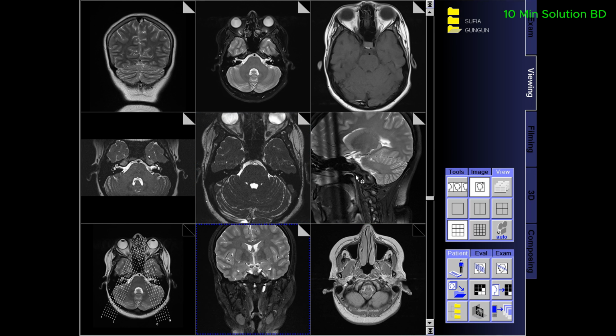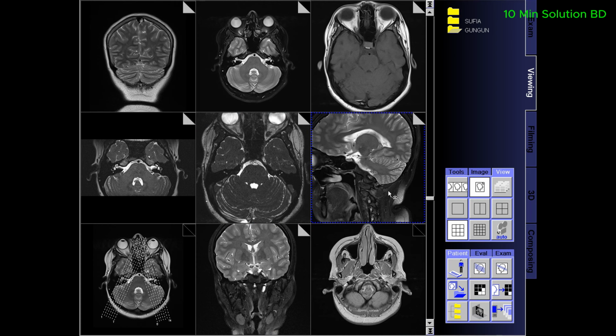Today I'm going to talk with you about MRI of the cochlea, or Cochlear MRI. Stay tuned and watch the entire video carefully. There's a lot to learn.